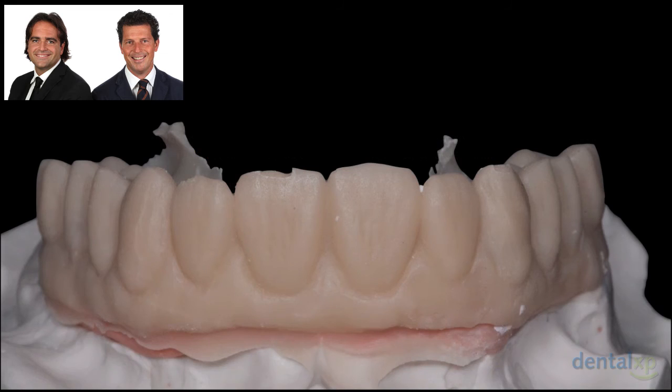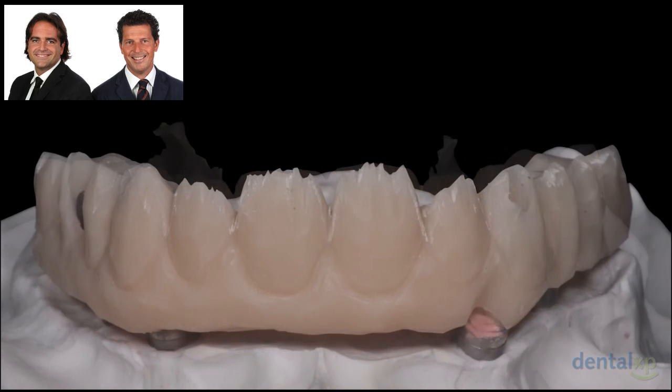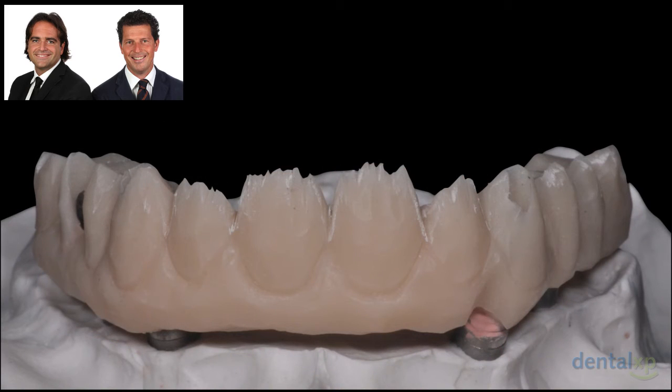And here you can see the great work of one of our lab technicians, Laura Morselli, who is taking her time doing all the characterization of the provisional. She is working on the function of the patient; we are working on an immediate implant provisional, so the occlusion has to be carefully checked, but not only the function, also the static.